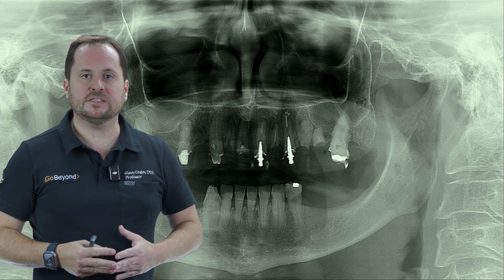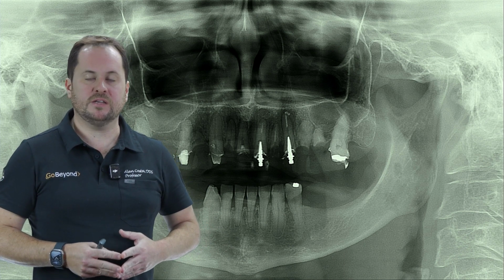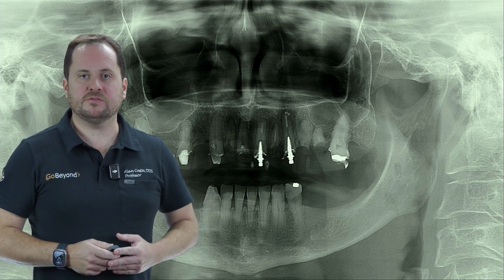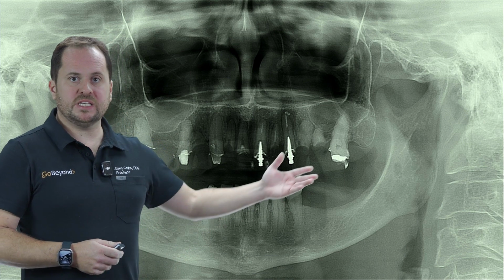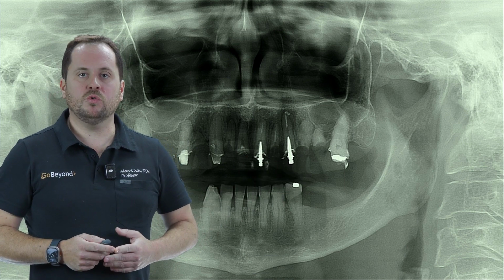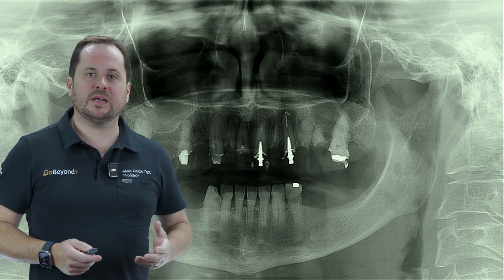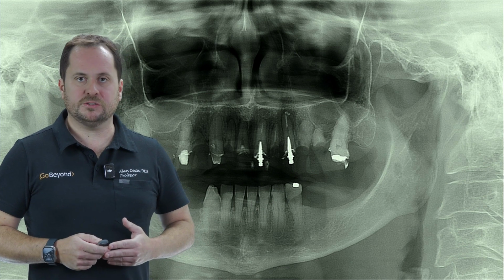Teeth in natural sizes and an artificial compensation, with the patient's artificial gingiva compensating for the loss of gingiva the patient had or will have from a reduction of the bone structure. So many people would think, wow, I regularize the bone structure and place a protocol. But what if we use a PF1 type prosthesis for the patient, working with the patient's natural teeth?